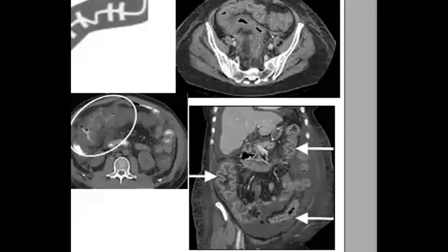If you find that this patient has diffuse thickening, especially in the cecum and maybe the terminal ileum, and this patient has a history of leukemia or is having chemotherapy, and the blood picture of this patient shows severe neutropenia, there is one type of infection that happens especially in patients who have chemotherapy.